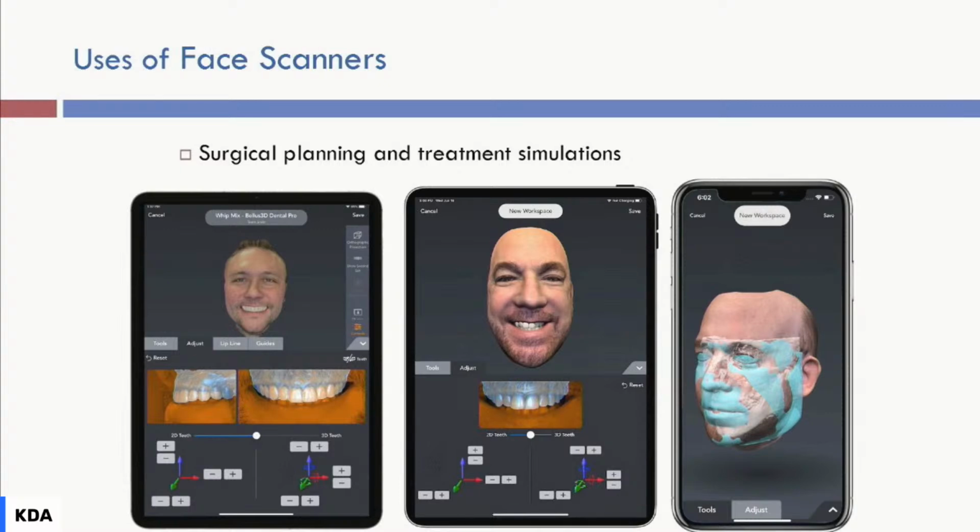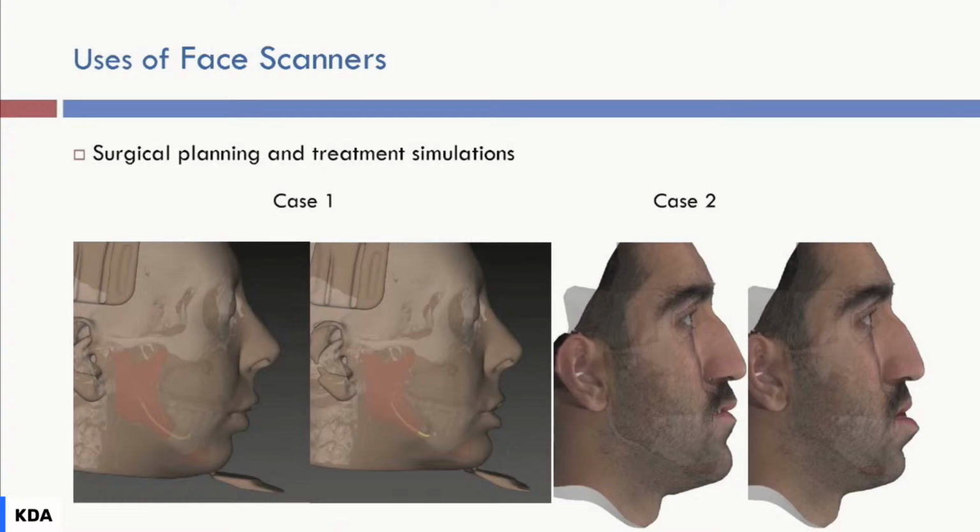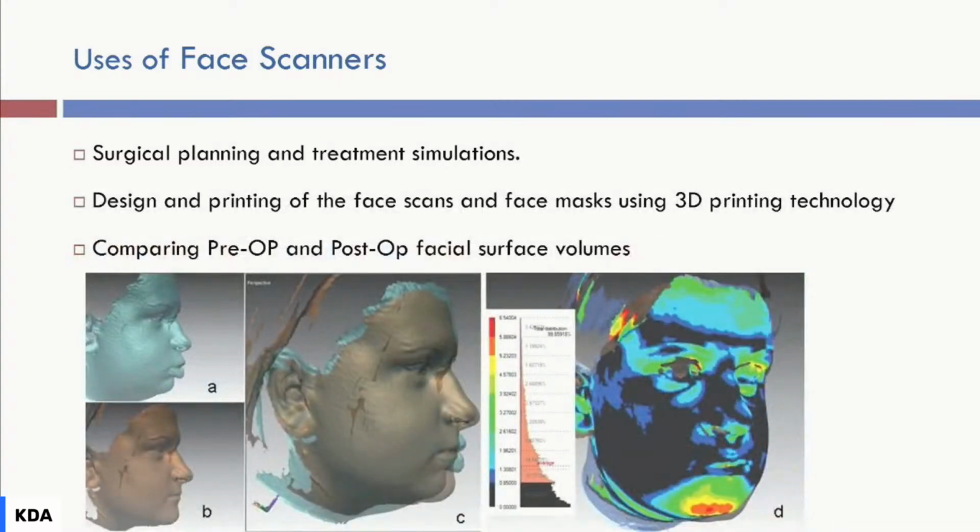At the same time, you use a scanner to take intraoral scans and augment them together, trying to come up with a 3D model. And based on that, you can decide on the crown length and all of that, even the color and the morphology of the crown. So it's coming up to dentistry, and here I'm going to focus on our field in maxillofacial surgery and how we utilize it to increase the efficiency of our surgeries.